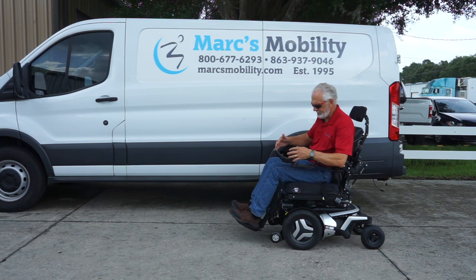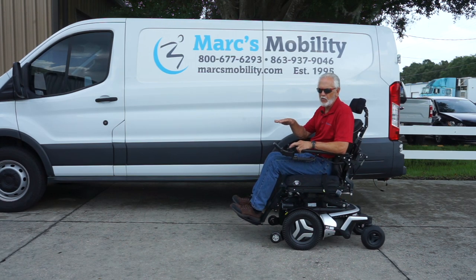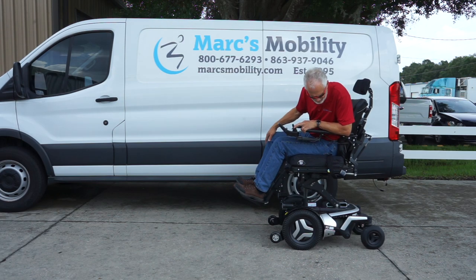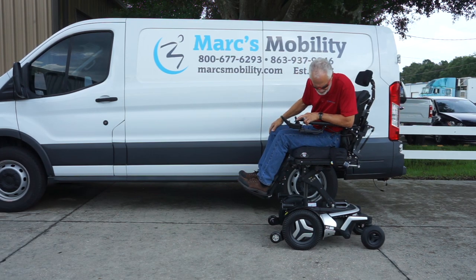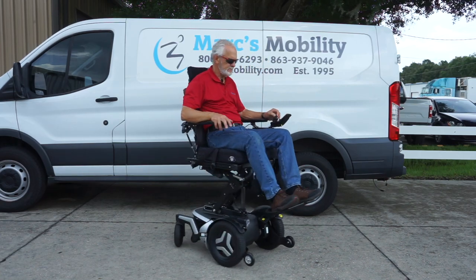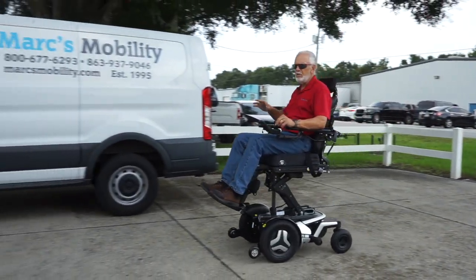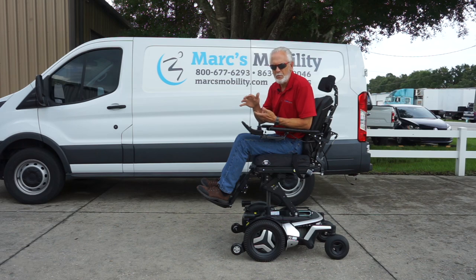Now I'm going to elevate the seat so you can see me driving the chair with it elevated. The seat starts at 22 inches and goes all the way up to 34 inches. You can drive up to three miles per hour with the seat elevated — that's faster than walking speed. But if you drive with the seat elevated, please stick to nice flat areas. These are great chairs, but they're really not made for the backyard with the seat elevated.